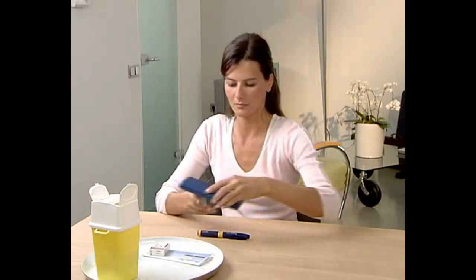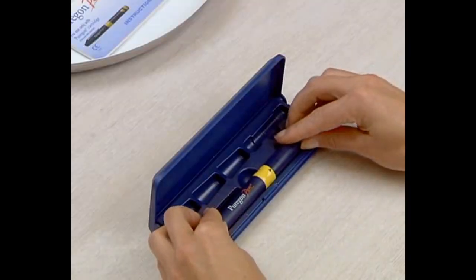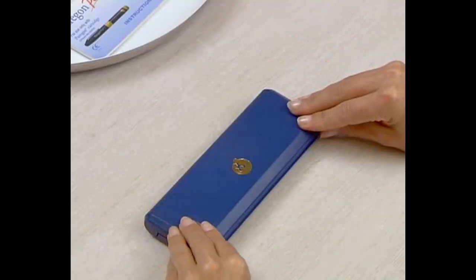Store the pen with a cartridge in it, either in the refrigerator or in a safe place, out of the reach of children.